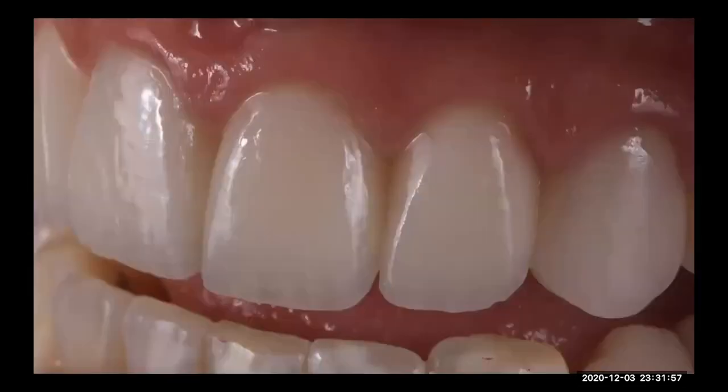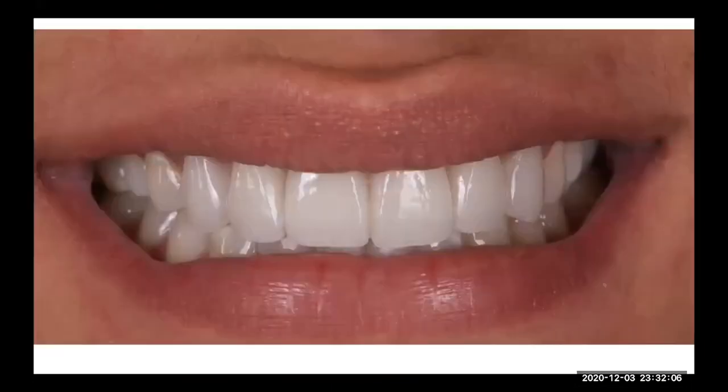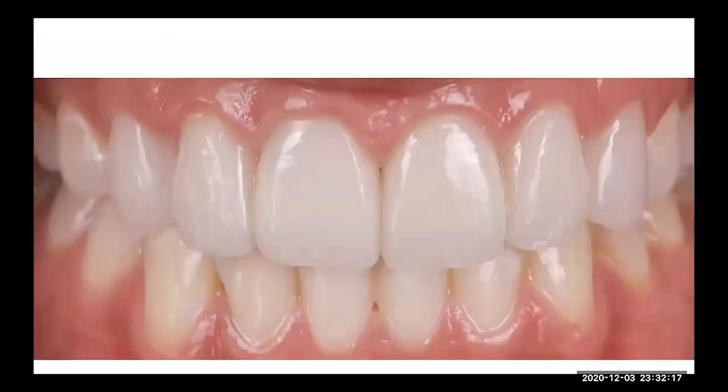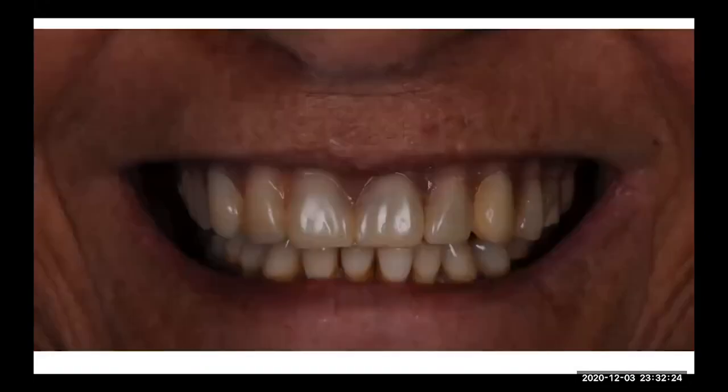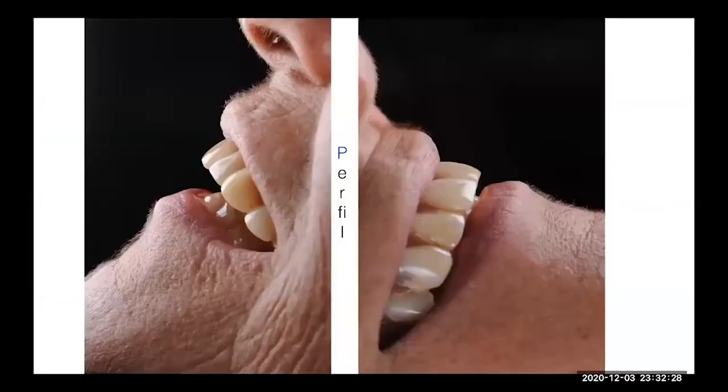So this is the case 6 months later. We can see here the texture, all the anatomy. It's something soft, something that breaks the incisal edge and makes everything non-monolithic. It creates the 3D effect. Okay, this is the case. We can see the integration in the soft tissue. And in big cases, we can do the same. For the implant cases, we can do the same.